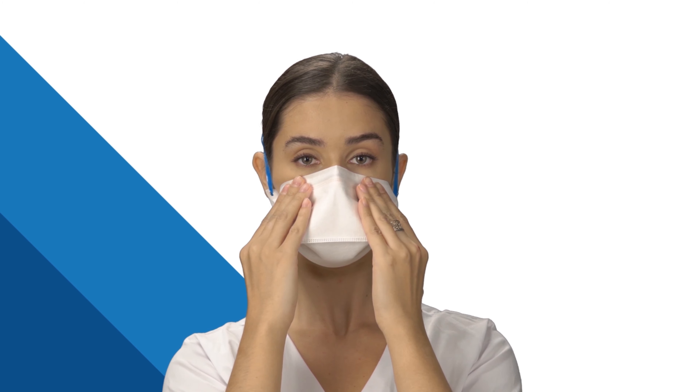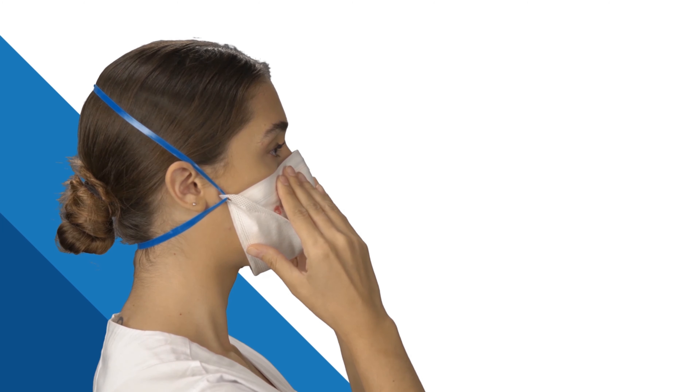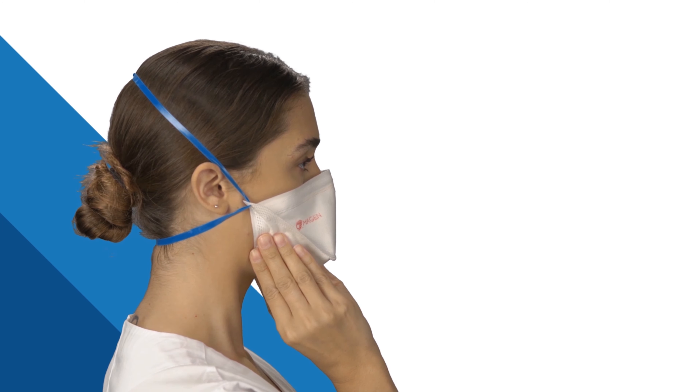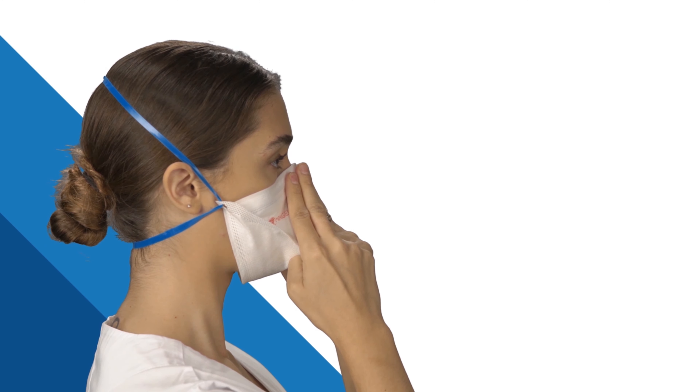After wearing the mask on your face, test the fit and the seal as follows. Put both hands gently in front of your mouth and nose, then exhale sharply. Be careful not to disturb the position of the respirator.